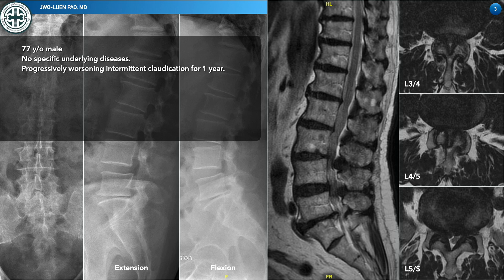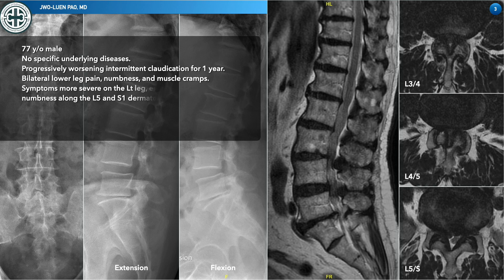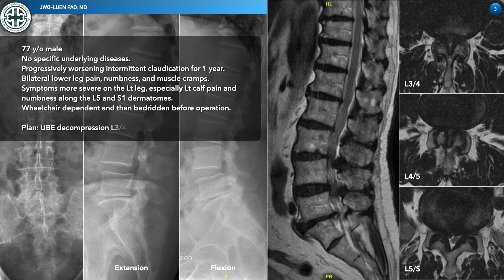As we checked the MRI, we see there is severe stenosis at L3-L4, L4-L5, and L5-S1, most severe at L3-L4 and L4-L5. But the patient has very severe S1 symptoms. So we decided to do the L3 to S1 decompression using the UBE technique — specifically ULBD — for this patient.